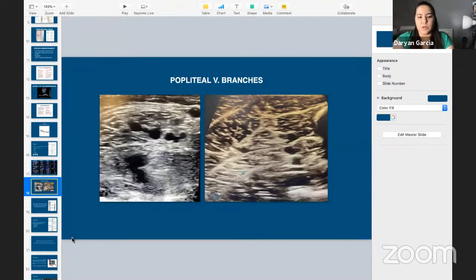So this is the image that I was telling you about. Here you have your popliteal artery, popliteal vein, and gastrocnemius vessels. The veins, the artery, veins, artery, and then here's the small saphenous vein. So you can evaluate a few things when you're in the popliteal fossa. Look for a Baker cyst, whatever the case may be with that patient. And then back over here, we have the PTVs and the peroneals, and then the soleal sinuses as well.